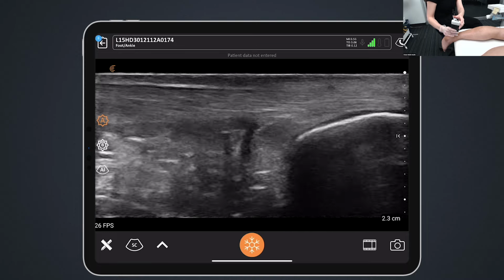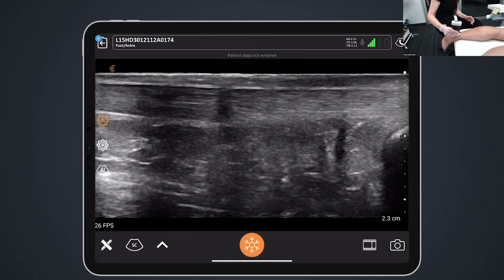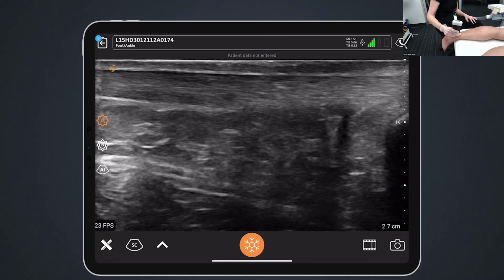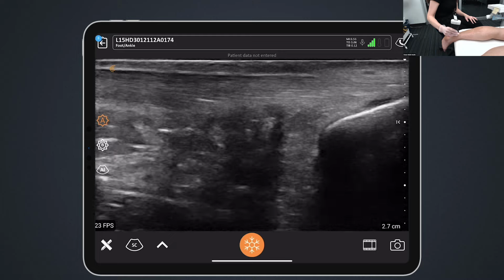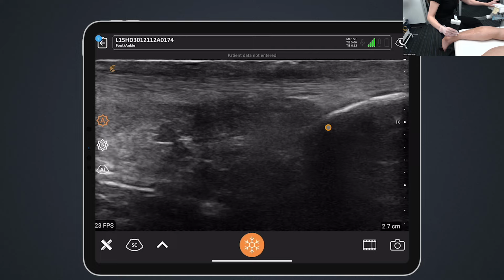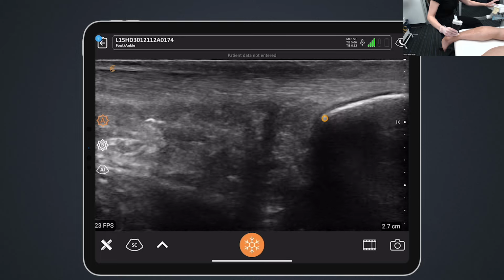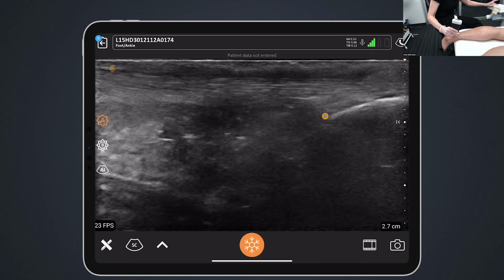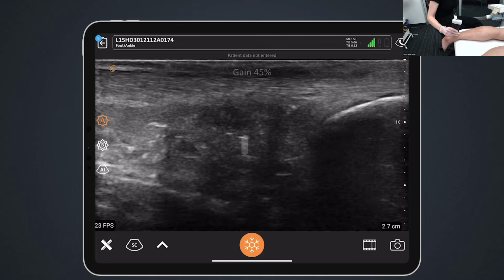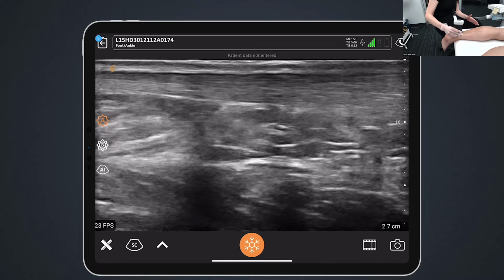So we'll move up towards proximal on the tendon, and just deep to the tendon there, we can see Kager's fat pad come into view. And just in this little cove here is where we would see the retrocalcaneal bursa. And if we compress, we can see the fat from that fat pad moving into that bursa right there. It kind of slides in and out. And let's move up proximally.